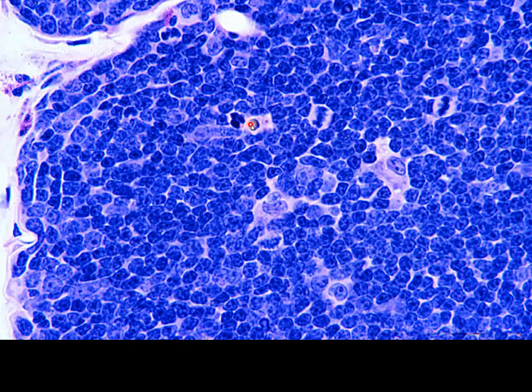So remember, in the thymus, this is where we're going to screen these cells. And if they don't pass muster, if they don't bind with the correct affinity, or if they recognize self-antigen, they're going to be signaled to undergo apoptosis. And apparently these cells have done so, and they are in the process of dying to be removed by cells such as macrophages.